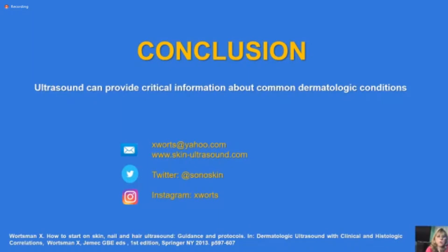So, in conclusion, ultrasound can provide critical information about common dermatologic conditions.